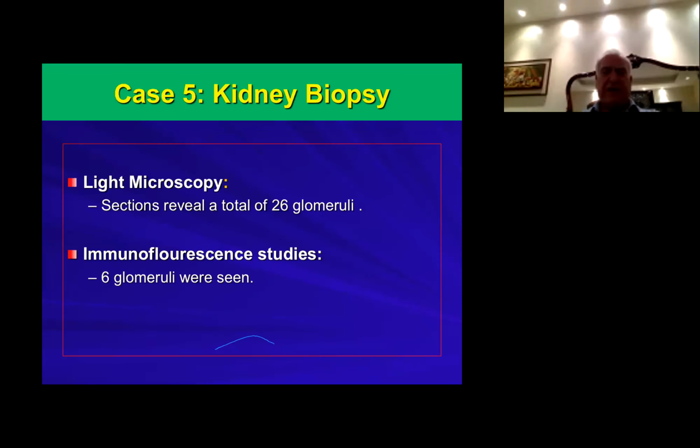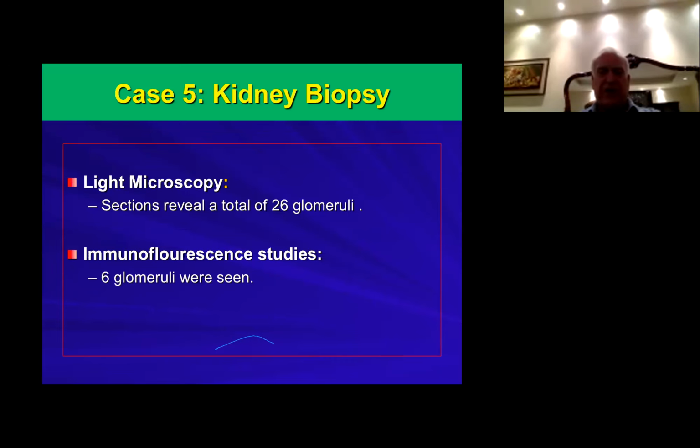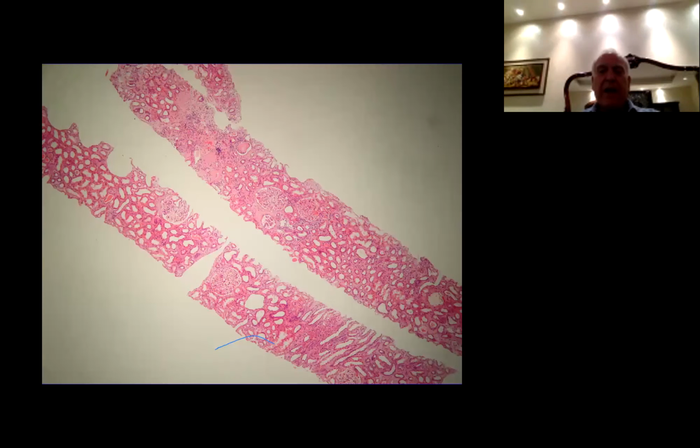Our next step, I think we should have a biopsy. There is no need to waste time. We have to have a kidney biopsy. So we did the biopsy. We are generous. We had one patient at one point with 96 glomeruli. Our fellows were so generous, taking four passes. Usually we take 3 passes, and we have a satisfactory kidney biopsy. This is her kidney biopsy.